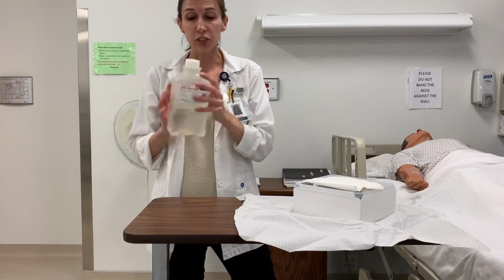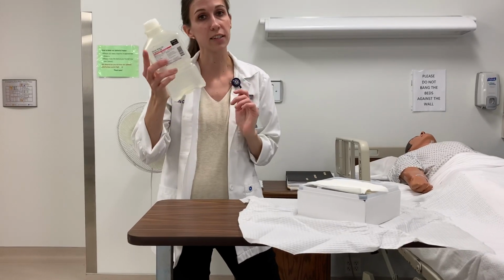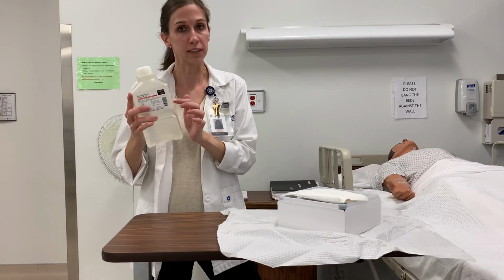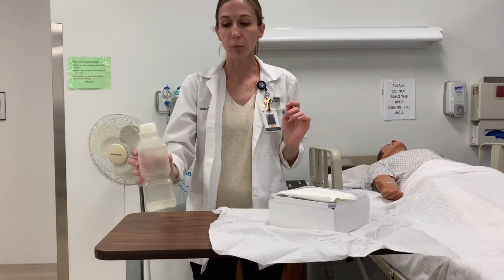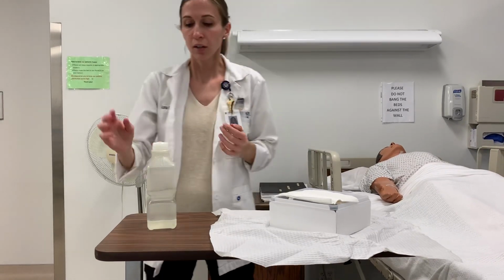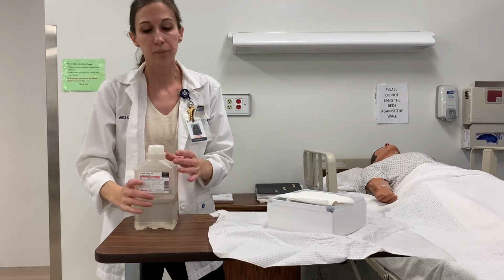If I'm going to be touching this bottle, I could not have sterile gloves on, right? So this is a contaminated bottle on the outside. The only part of it that's sterile is the fluid inside. So I can only touch with my dirty hands or clean hands, but not sterile. So for this again, this is contaminated, this is contaminated.